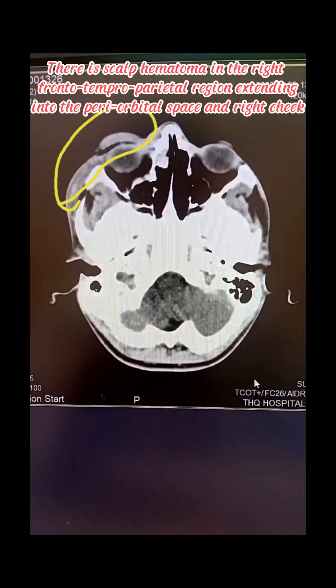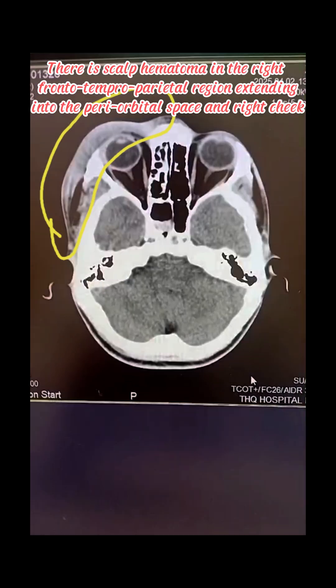There is a scalp hematoma on the right frontotemporal parietal region, extending to the periorbital space and right cheek.